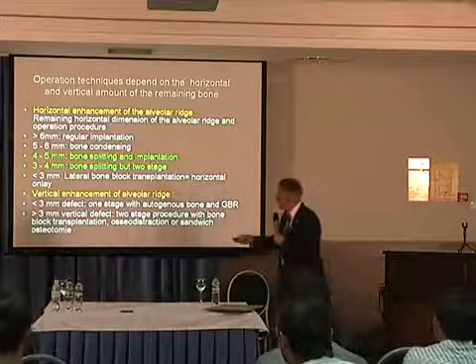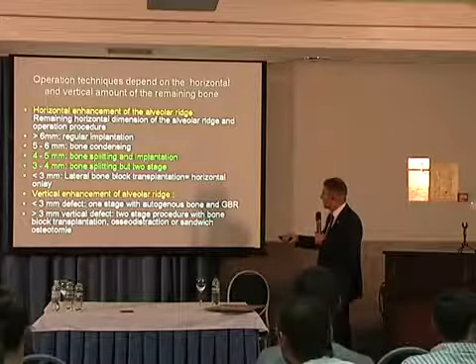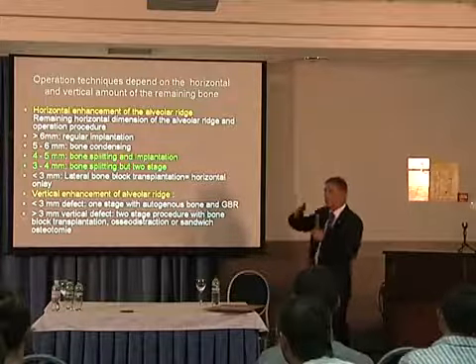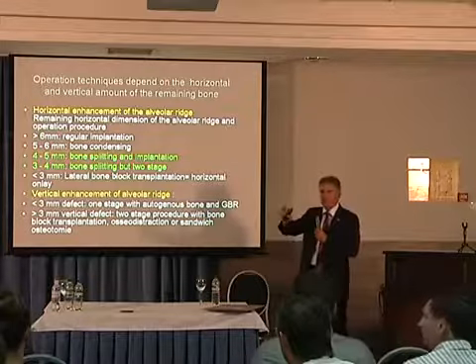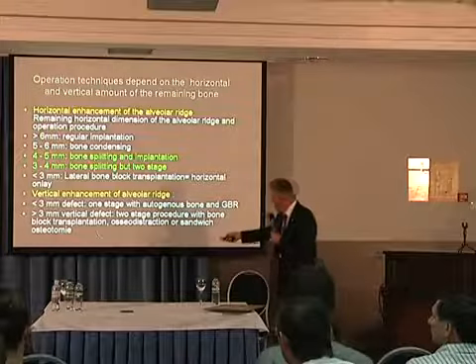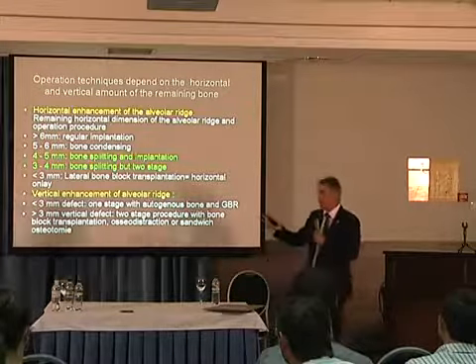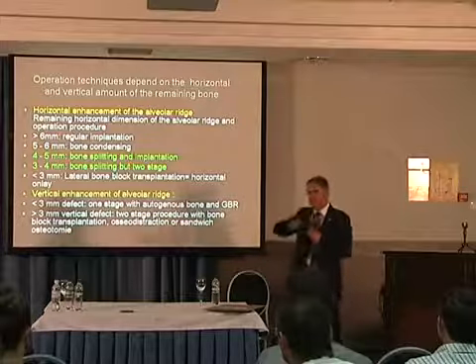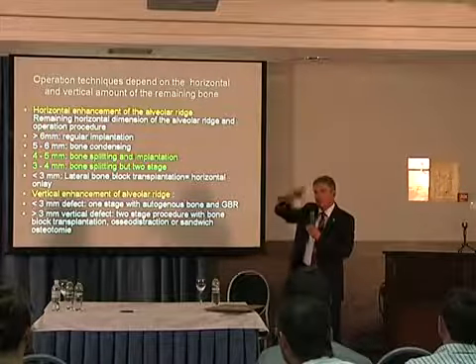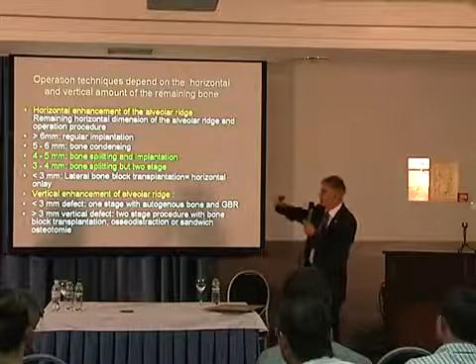So, in other words, more than 3 mm, we have to deliver 2-stage procedures with bone block transplantation or osseodistraction, which is very seldom and not very easy, with high compliance of the patient, or sandwich osteotomy. This is a very old technique I learned 25 years ago, but this is the same as osteotomy, the cut, but instead of an osteodistractor, you put just a piece of bone from here inside.